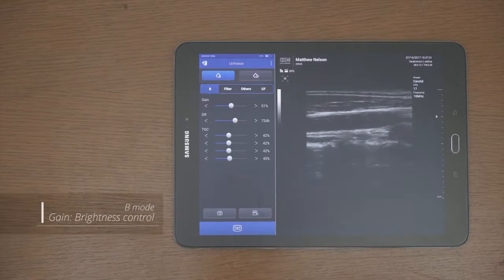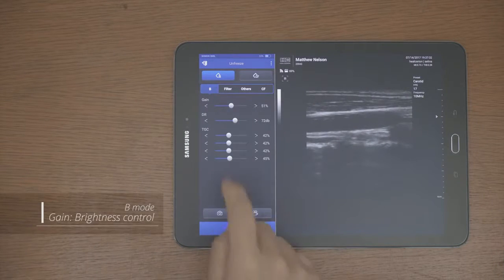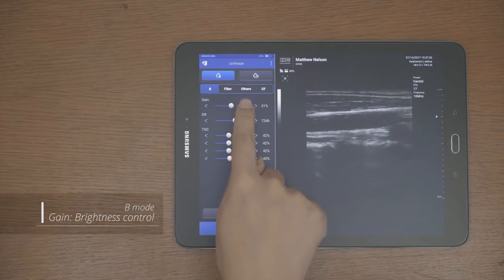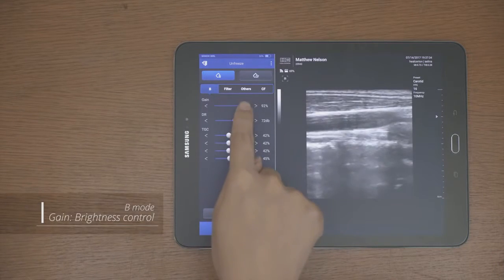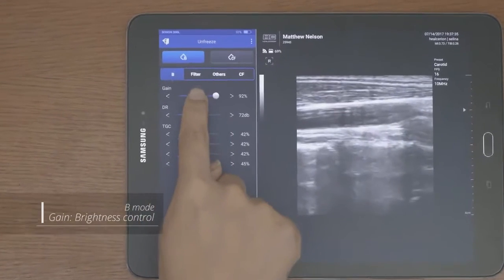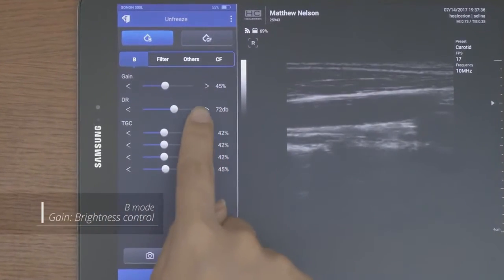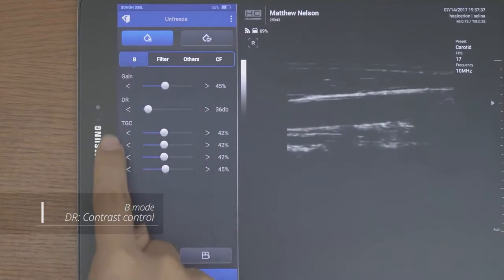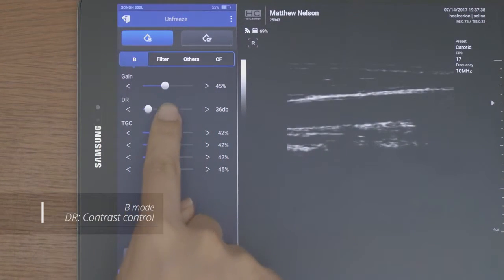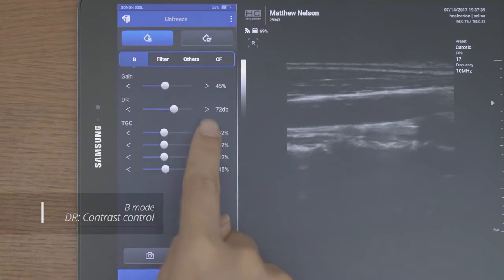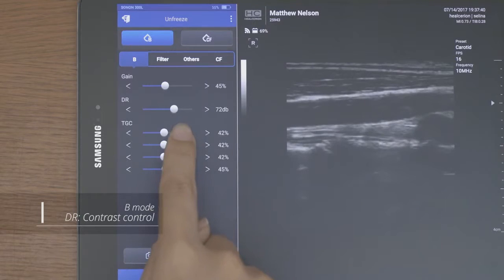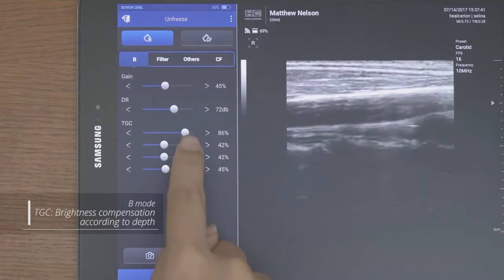You can adjust the image parameter values while scanning. There are gain, DR, and TGC functions in the B mode.